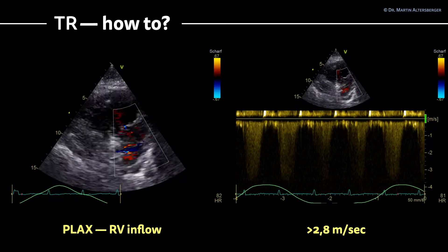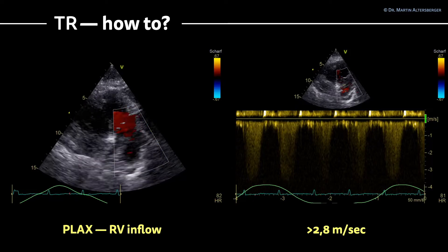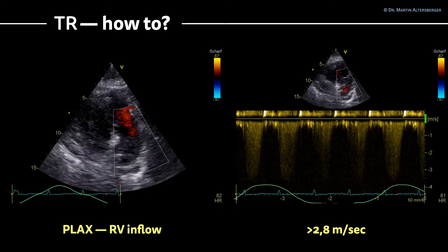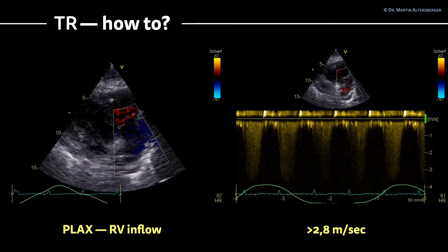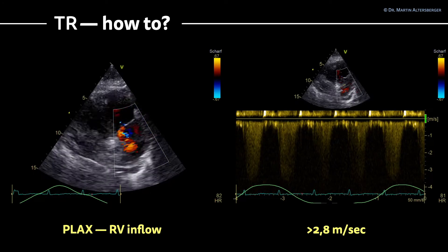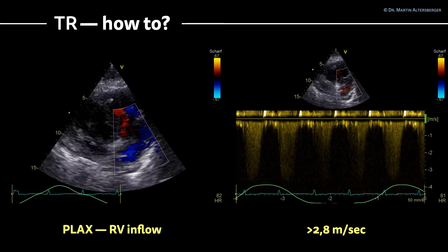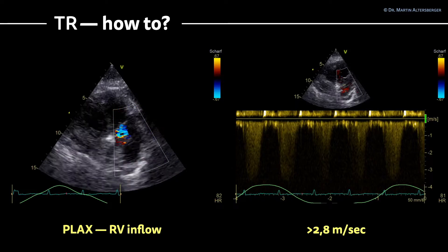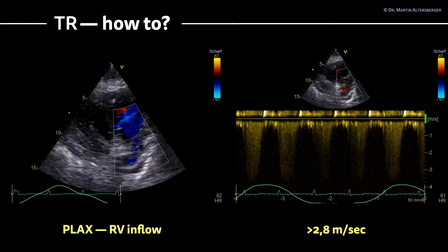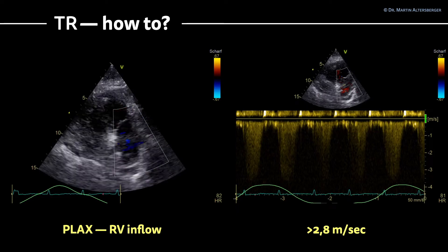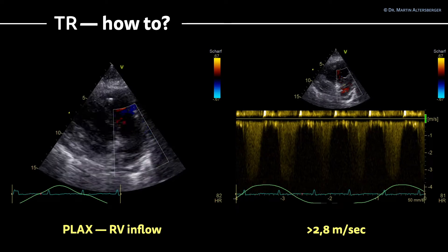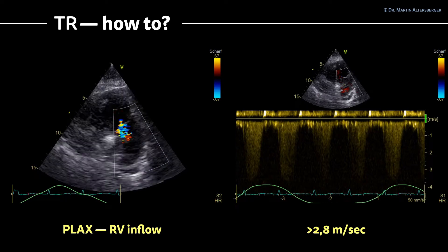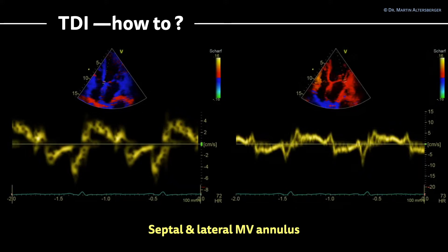Try it in all the views and compare your measurements to get the most accurate peak measurement of the tricuspid regurgitation. This is important to correctly evaluate the systolic pulmonary arterial pressure. To move on to the next measurement, we have to understand how to perform tissue Doppler imaging of the mitral valve annulus.